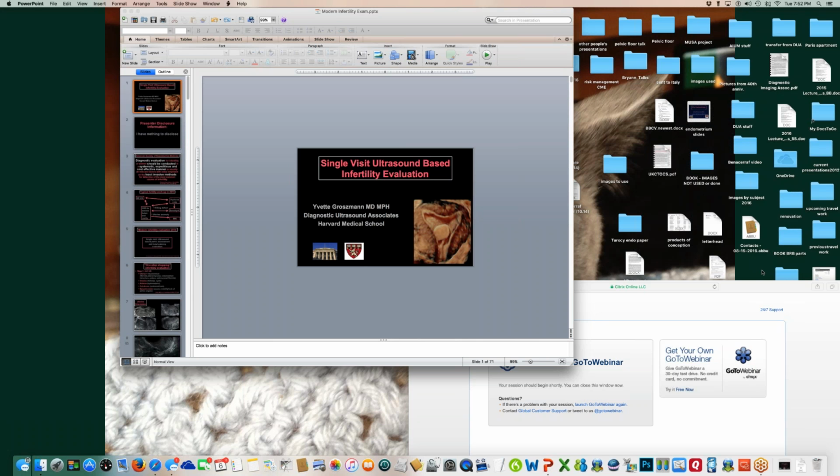The diagnostic criteria. What are the diagnostic criteria for a T-shaped uterus? We don't really have a good definition as of yet, and we also don't have a good definition yet of what constitutes a C-section scar niche. So, for now, it's just a subjective appearance of the uterus. If you notice that the waist, what I like to call the waist of the uterus, the part where the majority of the endometrial cavity is, that should be triangular. If it's really, really narrow and then the tubes come out kind of looking like a T and there's a sharp curve, I call it a T.